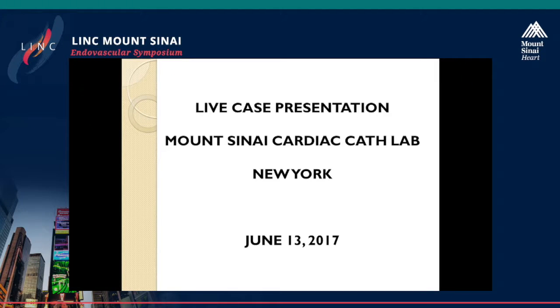Thank you very much. So now I think we have heard quite a lot about iliac and complex iliac disease. We move now one level down to the common femoral, and we will go directly to the cath lab. I think Prakash is already waiting with the next case.